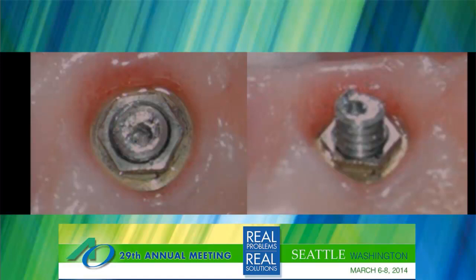This was a retired machinist. So basically, I pulled out the fractured component like this, and then I was able to make him 2 new screws, because try to find screws for a case that's 25 years old. IMZ's out of business, and the other one happened to be a 3i case, and I could get a screw for it if I waited 3 months and for about $180. So I just made 2 screws. So we solved the case.